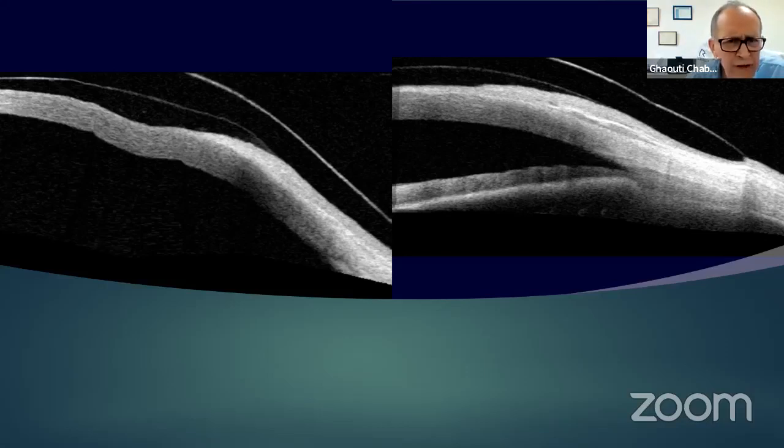I have a Hughes OCT, which also has an anterior segment model. The thing is that we have to change every time to put the lens and so on. It's a bit tricky. I know that there is a company where we don't need to put the lens to put the ocular on the other side of that.